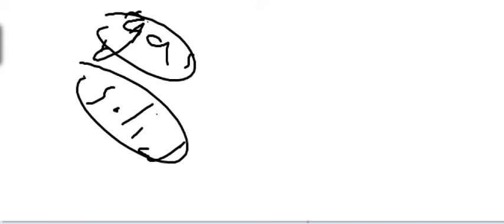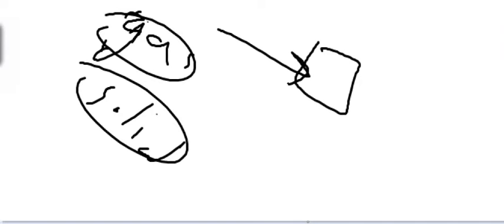Gas detector is just compressed gas in a metallic box, that when an X-ray photon hits it, gets ionized, gives you an electrical charge, and it's detected by the computer. I'm talking about CT scan now. The solid is the same idea, but it's a solid cube. Hit by radiation, ionized, gives an electrical charge.